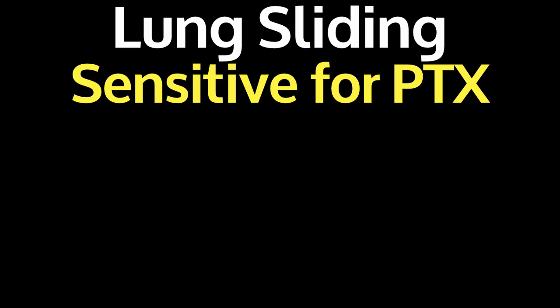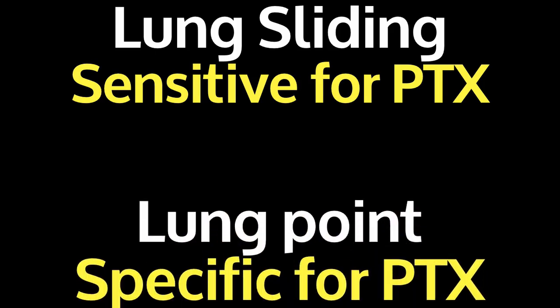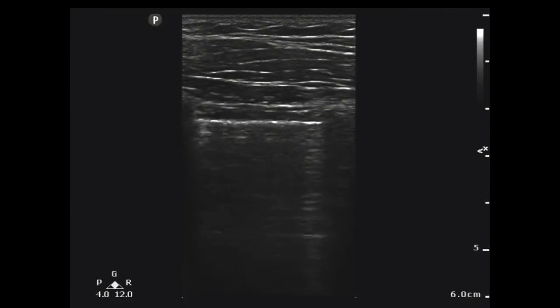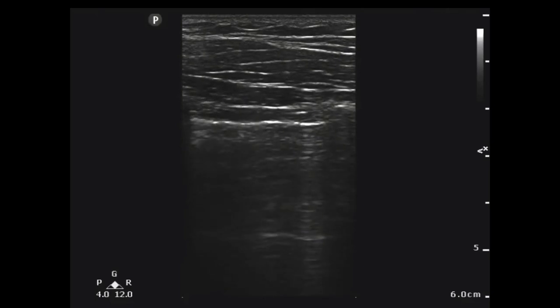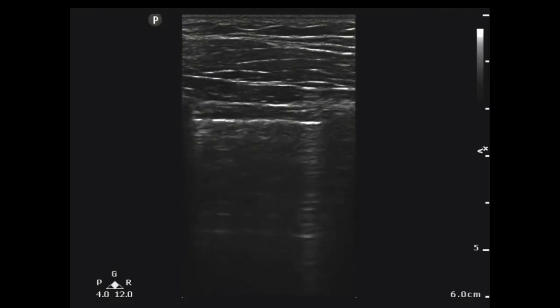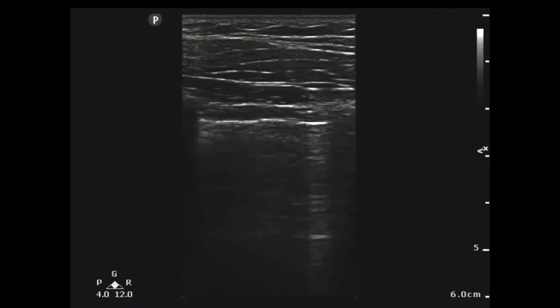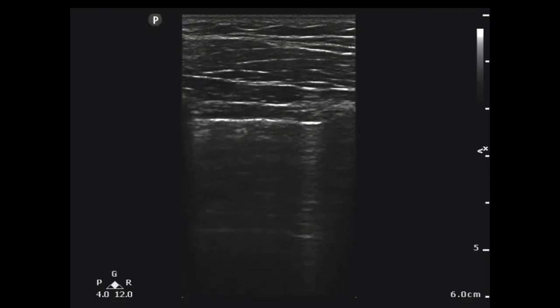There is, however, an ultrasound finding that has been thought to be very specific for a pneumothorax, and that's something called a lung point. This is what a lung point looks like. Notice on the left side of the screen, you actually see lung sliding — that white line is moving back and forth, left to right on the screen. However, on the right side of the screen, you just see that white line by itself without any movement at all. This is a lung point, and this is thought to be very specific for a pneumothorax.